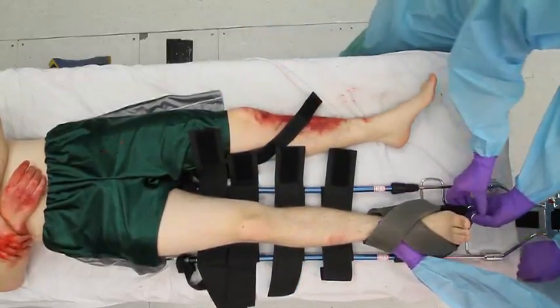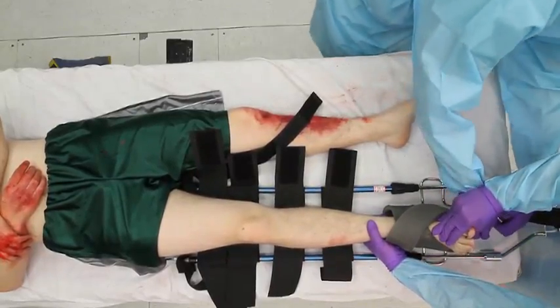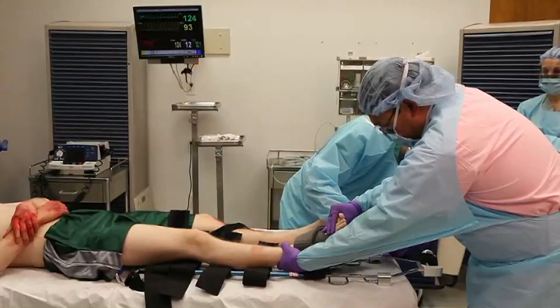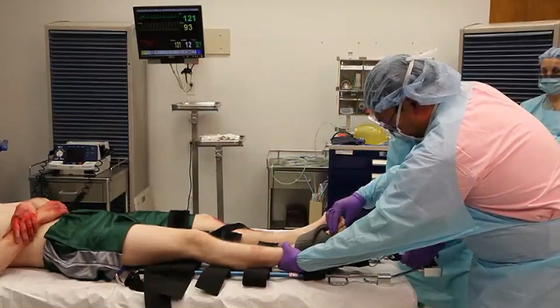The bottom strap should be slightly shorter than, or at least the same length as, the two upper crossing straps. Attach the ankle hitch to the traction hook, while the other person maintains manual traction and support.